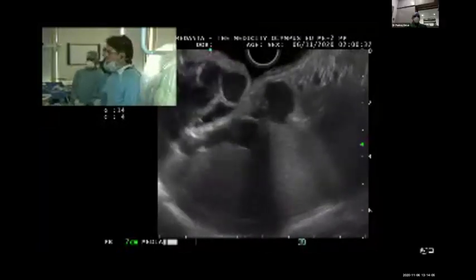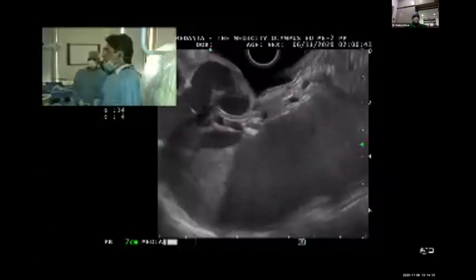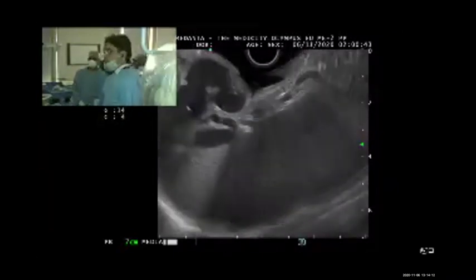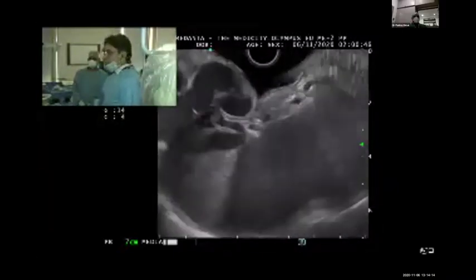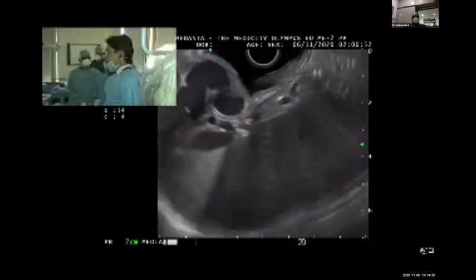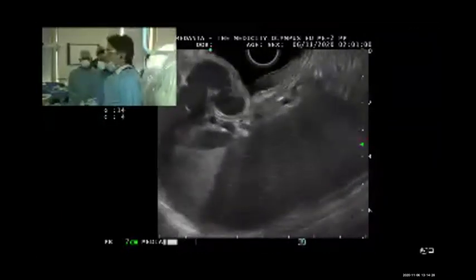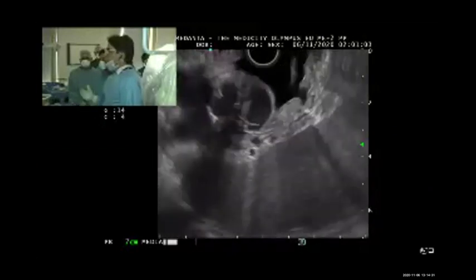Yeah, and just one small comment I would like to make regarding the use of lipiodol that you just mentioned. We have just published our series of more than 2,000 cases, where we have not used lipiodol in any. And you have done all EUS-wise? No, this is all simple. So Pankaj, it is a very good question. And we also do without lipiodol.